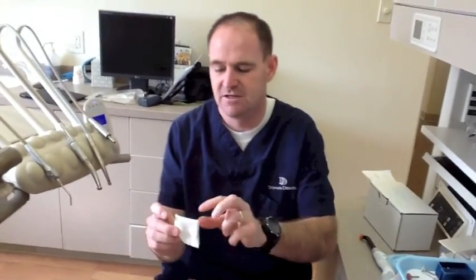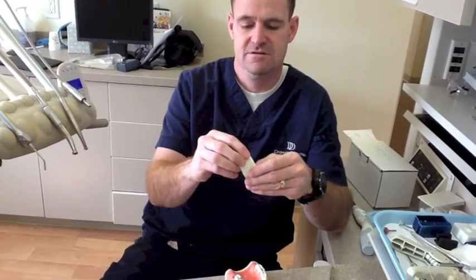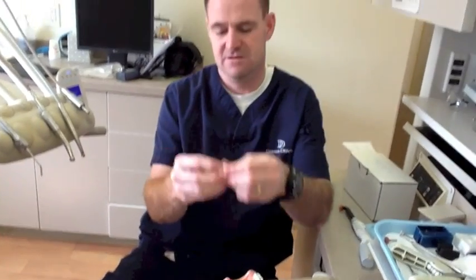And then I take some gauze, 2x2, fold it in fours. I get 2 of them. 2x2, I fold it in half. Fold it in half again, and tell them to bite down. Okay? And they bite down on that, and it has to stay there a minimum of 5 minutes. So we set the timer for 5 minutes. Once it's been 5 minutes, you come get me.